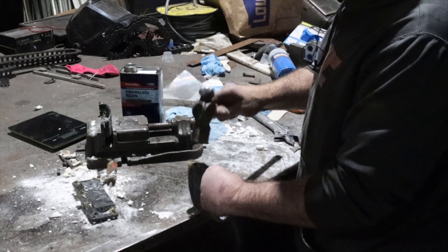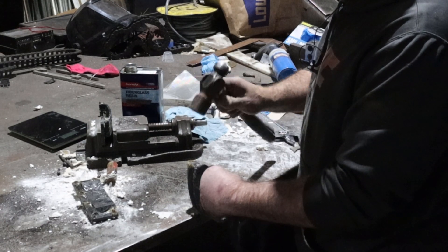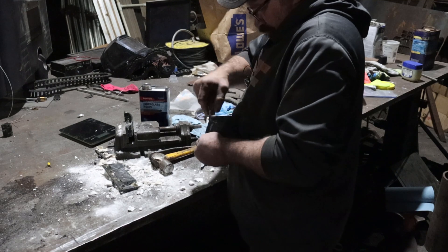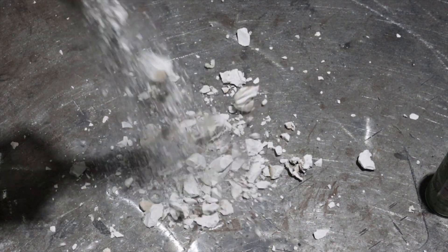The process of demolding the hard way is pretty self-explanatory. It involves a hammer, a screwdriver, a chisel, and some patience. Try not to damage the inside of the shell as you're picking away what used to be the best plaster mold that you've made to date.